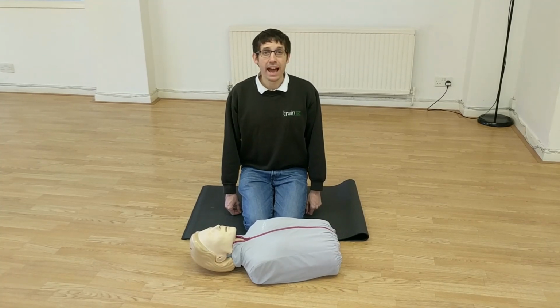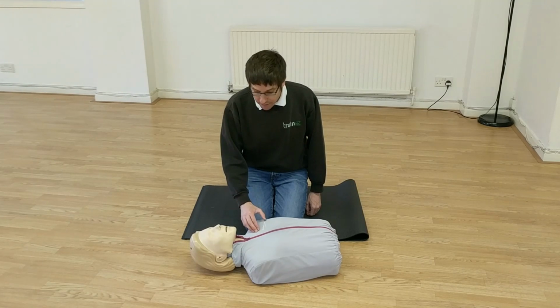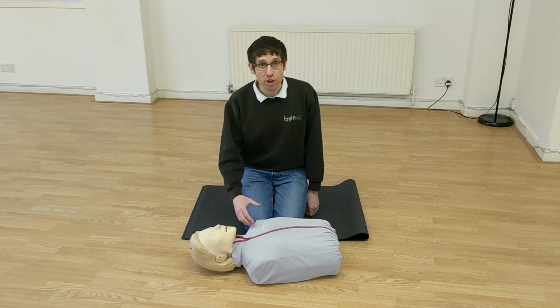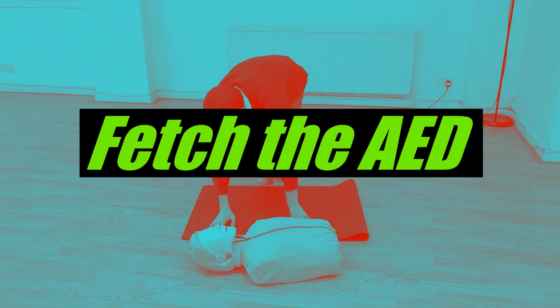Demonstrate a demo on how to use the AED. I've worked out the casualty's not breathing, I've called the ambulance, stated my location, and that the casualty stopped breathing, and I know there's an AED 30 seconds away, so I've got to leave it.